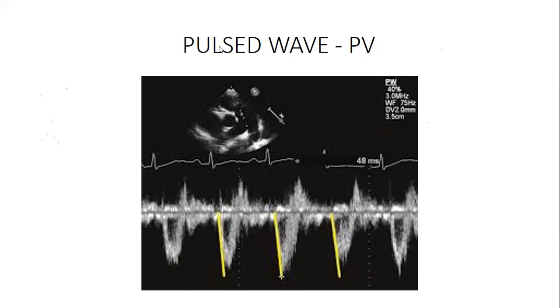I think it's like a practical situation in training, like what the previous speaker said. I have widely understood now Doppler and how important it is to know your anatomy. So if, let's say, I put the gate at the mitral valve, what structures am I seeing, especially in M mode? So I've seen the value of the M mode.